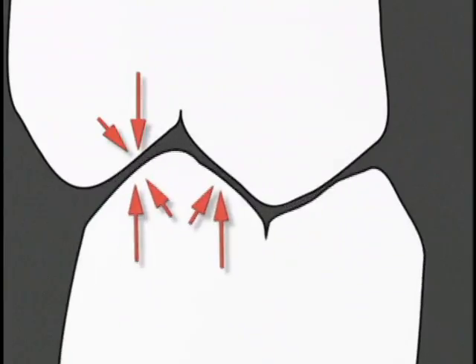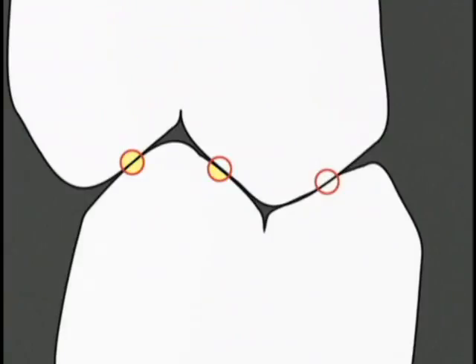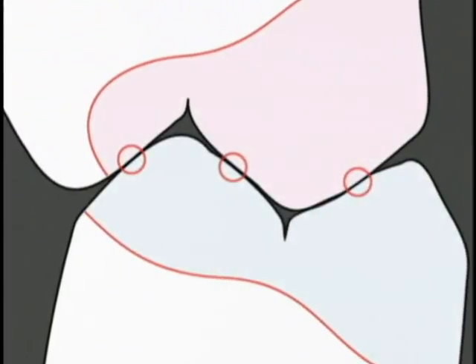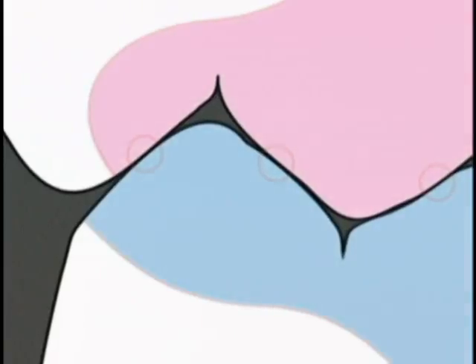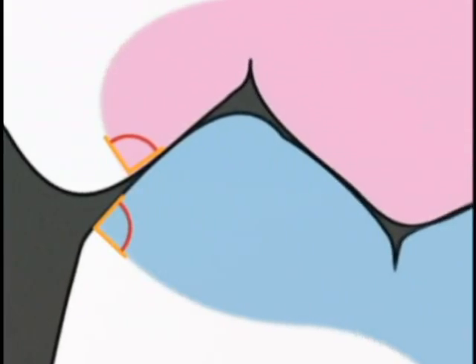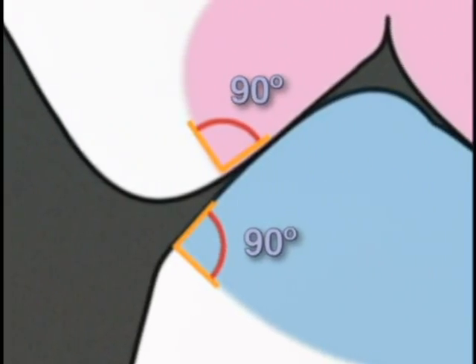Lower buccal cusps are stamp cusps, and they put more force on the opposing than an upper buccal cusp. Therefore, for strength and fracture prevention, the porcelain metal junction should never be placed in areas of a direct occlusal contact. Instead, they must be cervical to the occlusal contact. The porcelain metal junction of the metal occlusal must follow the anatomy and should never be a straight line. Also, the porcelain metal junction must be made at a right angle to the outer contour of the finished restoration.